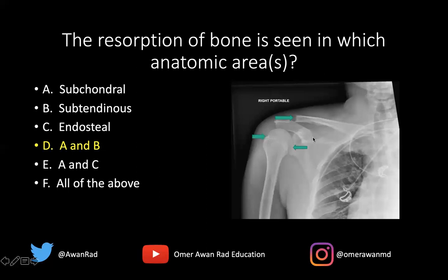There actually might even be subligamentous resorption. If you take a look along the undersurface of the clavicle, this is where the coracoclavicular ligaments run — between the coracoid process of the scapula to the undersurface of the clavicle. The trapezoid and conoid components of the coracoclavicular ligaments insert right here. So there's even evidence of subligamentous resorption, but that wasn't included in the answer choices. So the best choice here would be A and B.